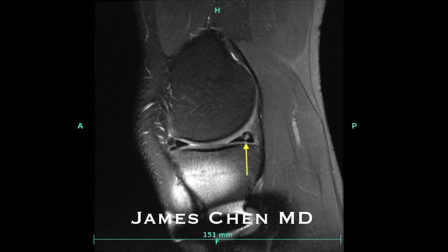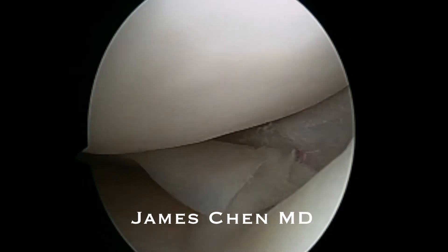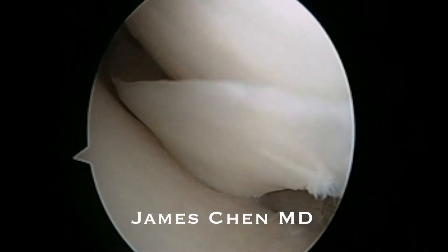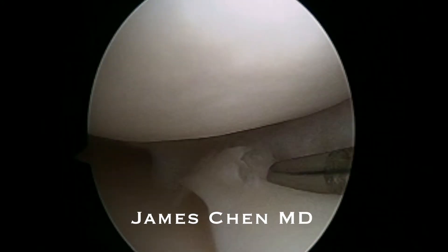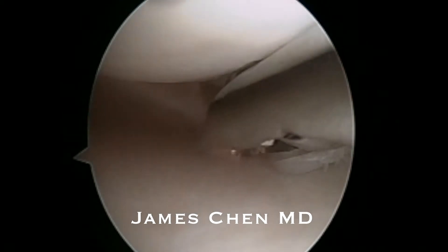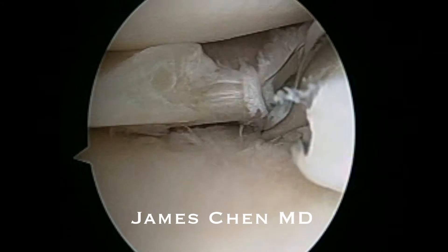There is an arrow pointing to the meniscus tear. At the time of surgery, you can see a non-healed bucket handle tear that is complex and cannot be repaired again. Even though it is in the red-white zone, the tissue is not viable for repair. He has a vertical graft and tunnel in his knee, and therefore a repair will fail.